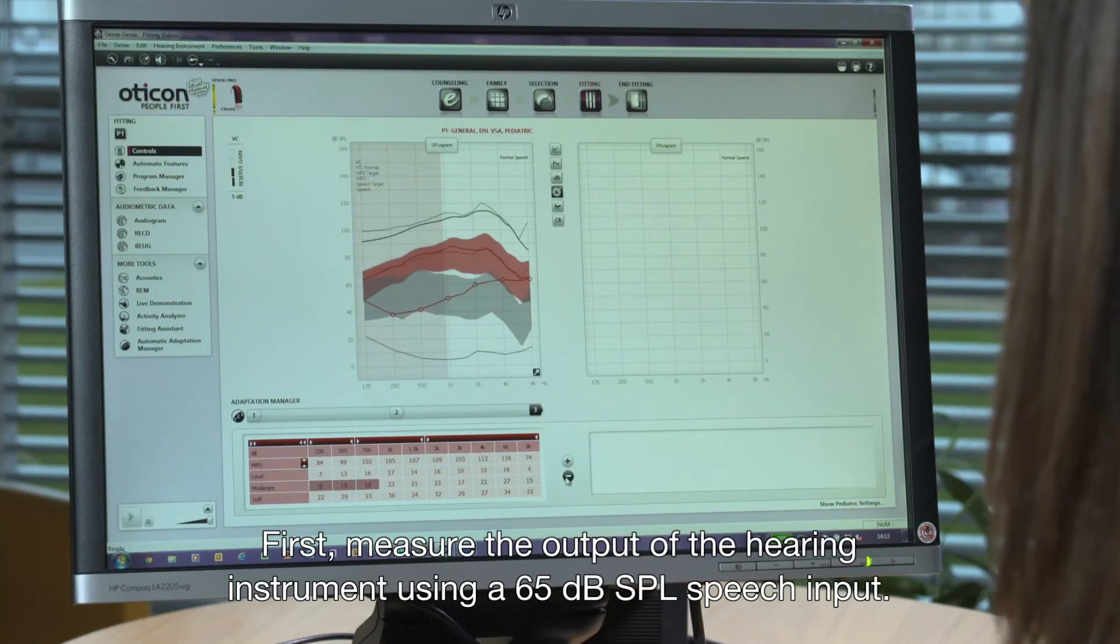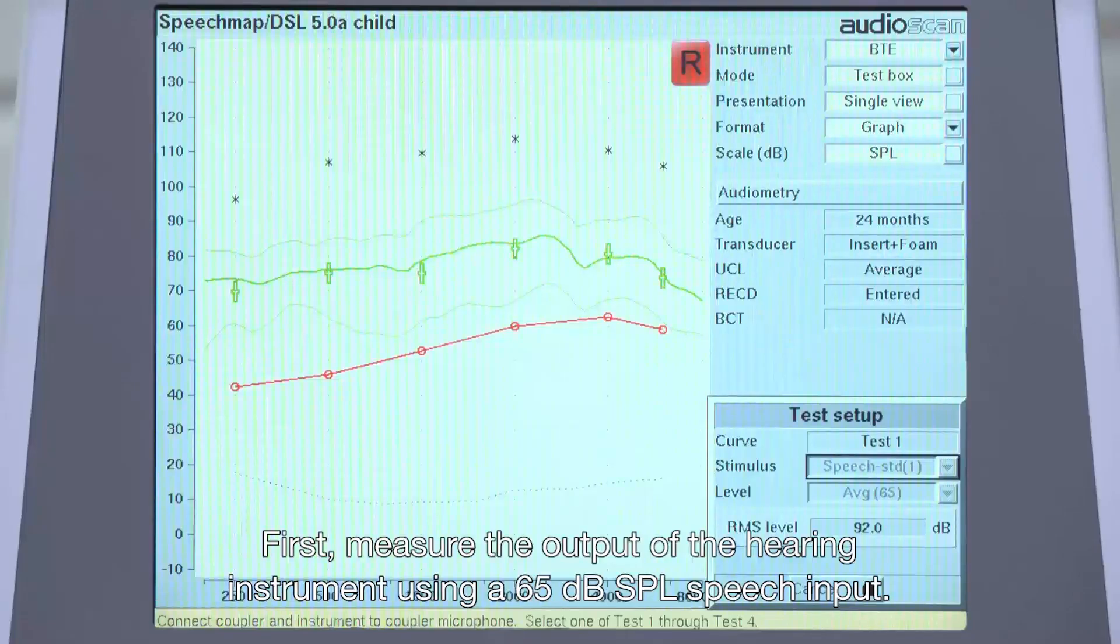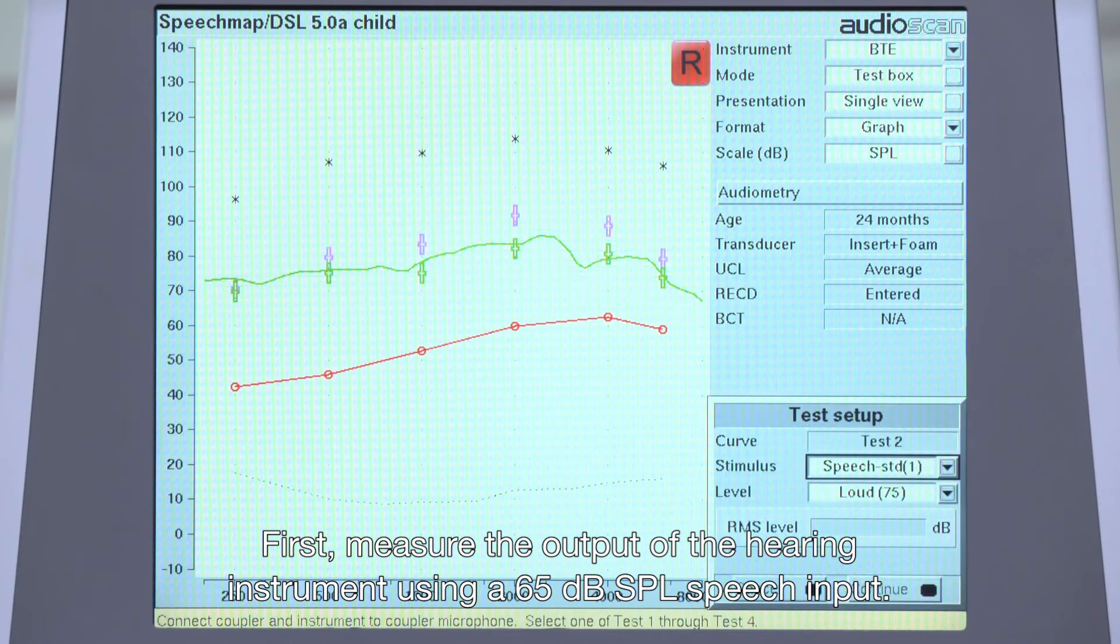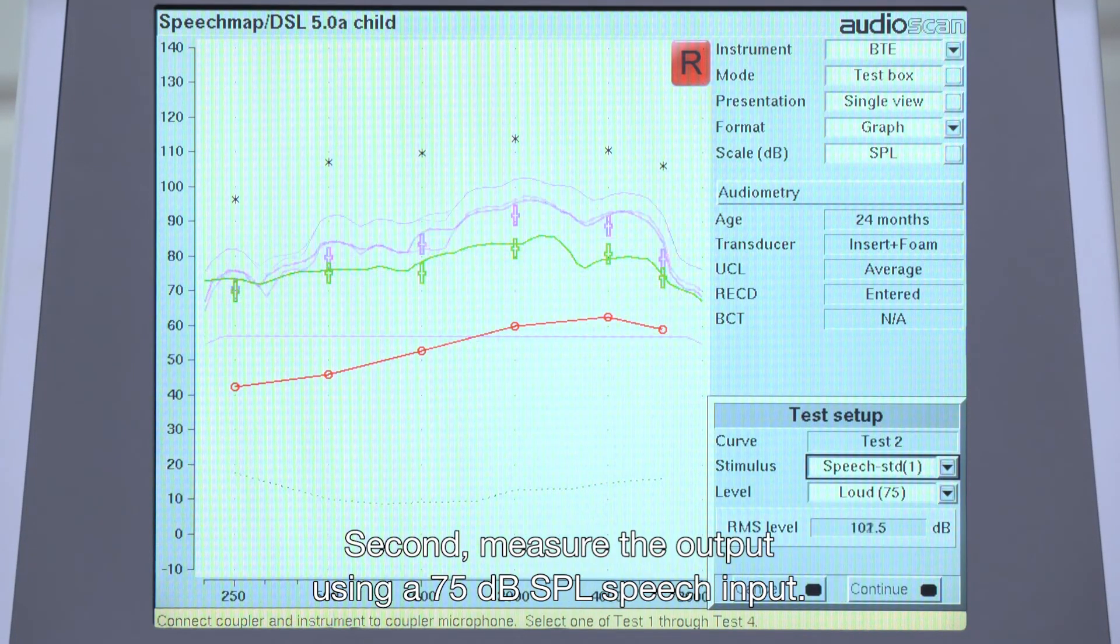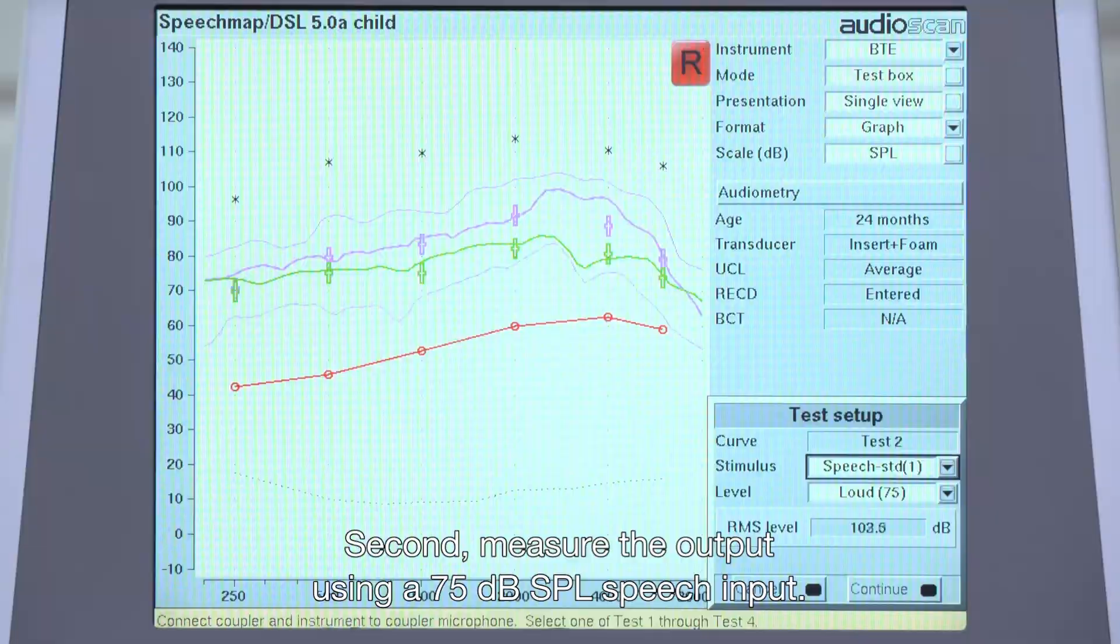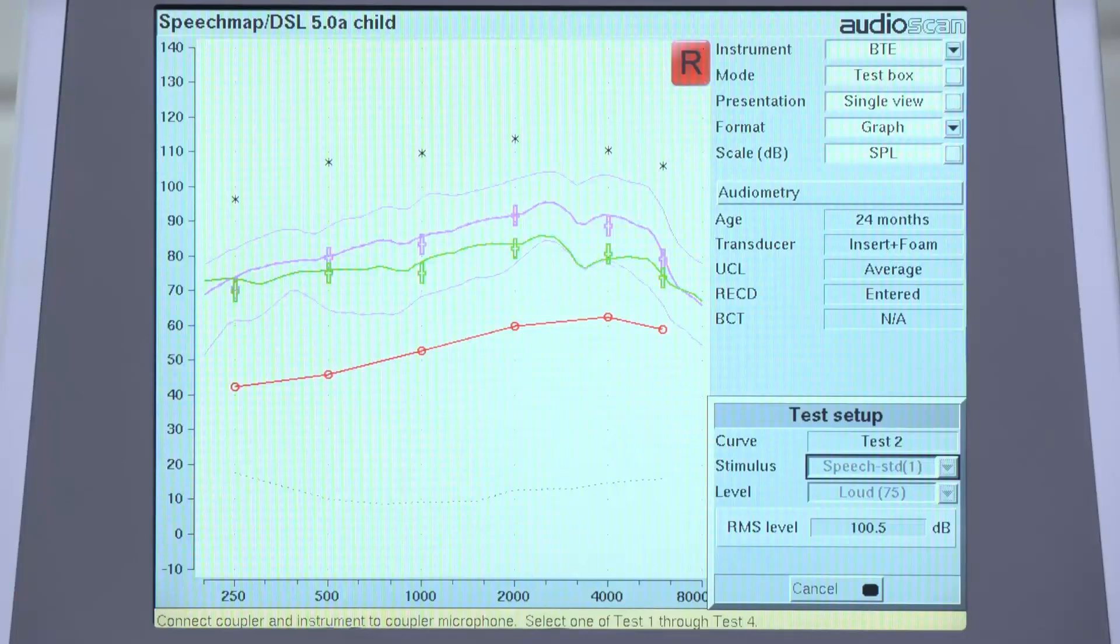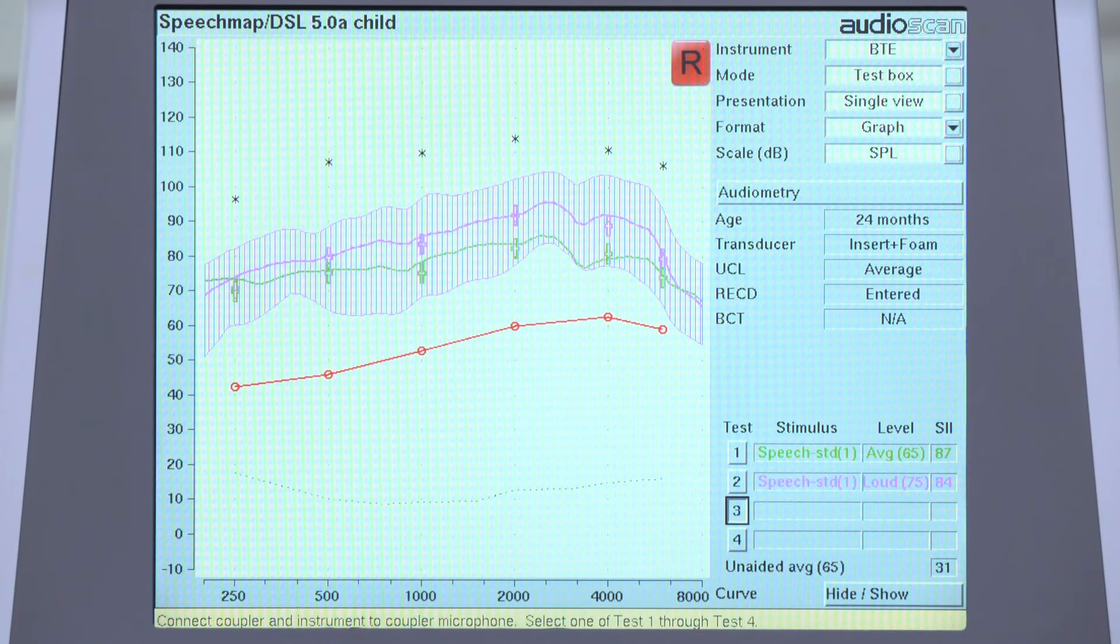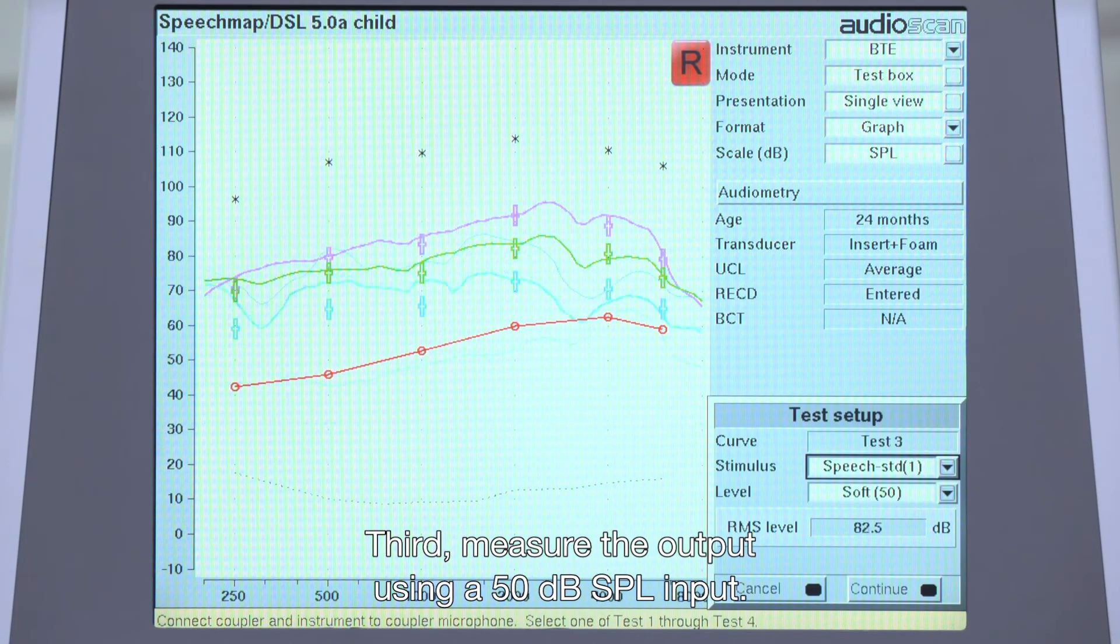First, measure the output of the hearing instrument using a 65 dB SPL speech input. Second, measure the output using a 75 dB SPL speech input. Third, measure the output using a 50 dB SPL input.